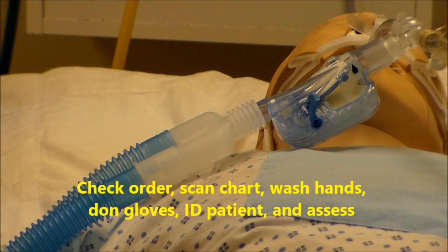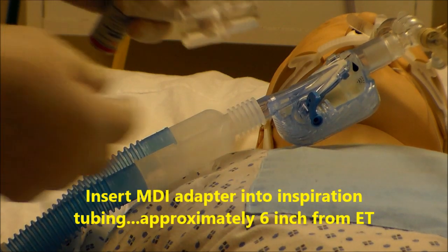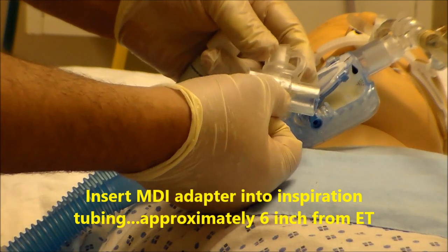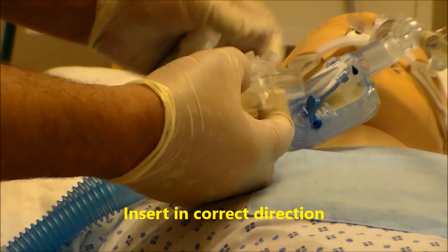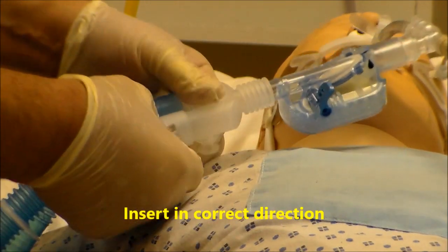At this point you would insert an MDI adapter into the inspiratory side of the vent circuit. There is a little arrow on the adapter — make sure that is going towards the patient.